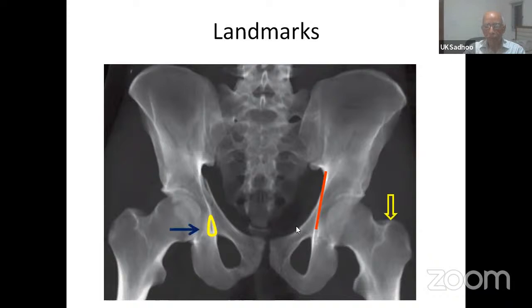So next, for seating of the stem, because you would have already templated, but a rough trick is to drop a perpendicular at stem seating, or the rasp seating, the trial stem, and drop a kind of perpendicular to the trial head. It generally falls in the center of the head. This is a very quick reference trick, apart from a very accurate measurement guide.